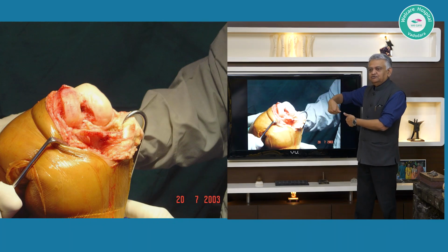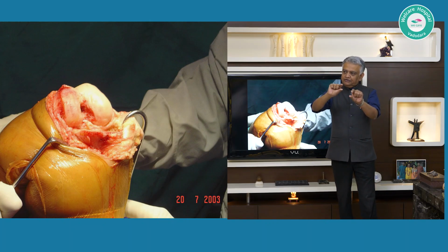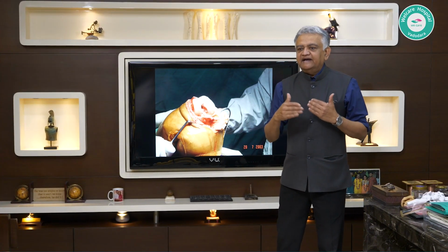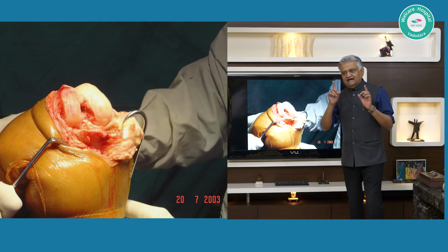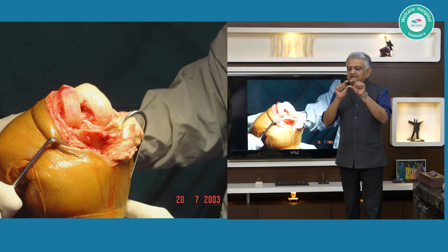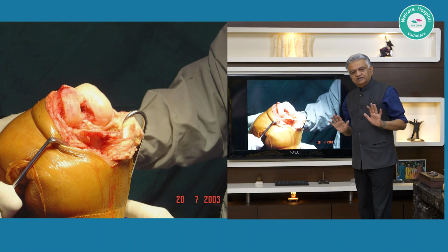And then similarly, as you go into flexion, will that rectangular gap remain like this? Would it go into a bit of this tilt or that tilt? All those complexities are added as you go along the path of examining this entire approach. But the underlying essence, if you have to bring out in one statement, would be: create a well balanced, equal rectangular gap in extension and at 90 degrees of flexion and all throughout that range of movement. This is the long and short of knee replacement.